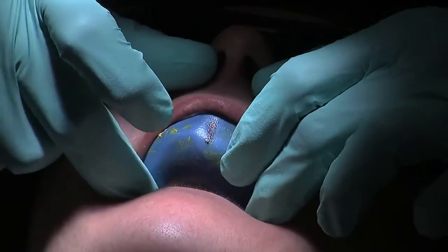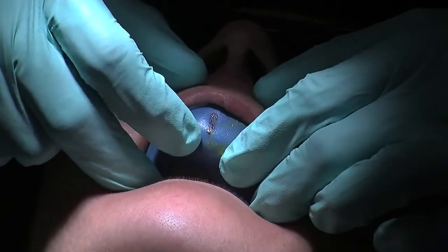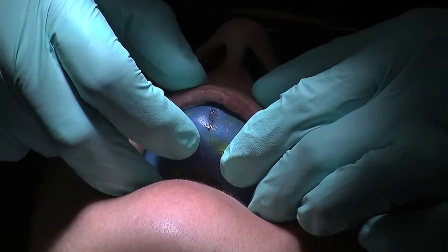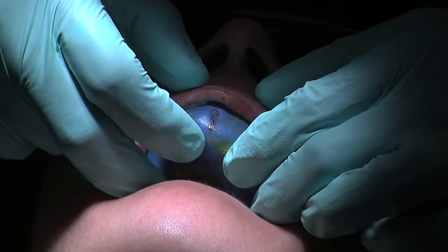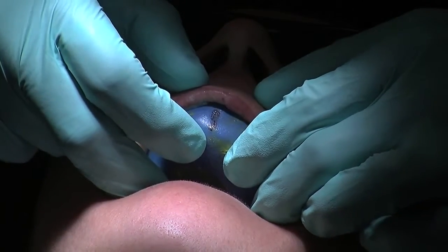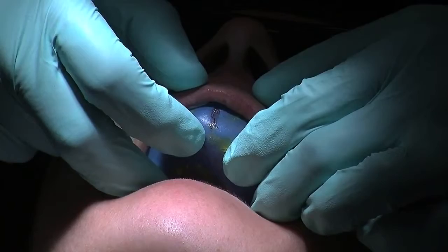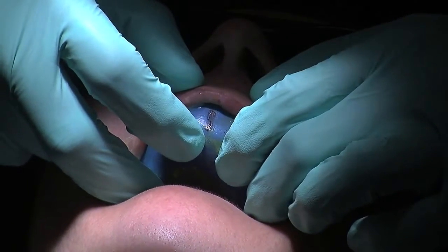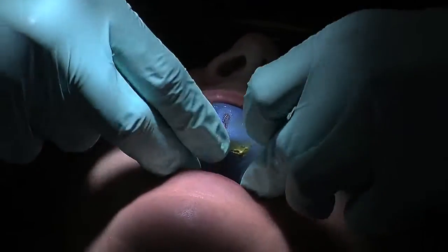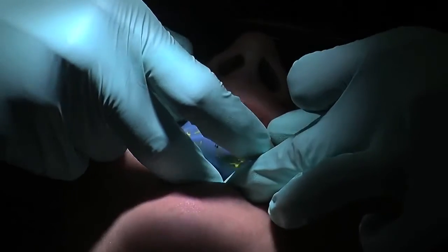Just relax your lip. And I'm going to use that mark so I know I'm fully seated. I can feel positive pressure, it's firmly seated, and I'm going to hold this in place nice and tight now. That's the key thing. And you need a good amount of putty in the palate so that there's no movement anteroposteriorly of the putty index at all. So with 4 fingers, there's fairly firm pressure holding in place now for a good 2.5 minutes. So I'm going to take this out now. Just literally in one go, just remove that down.